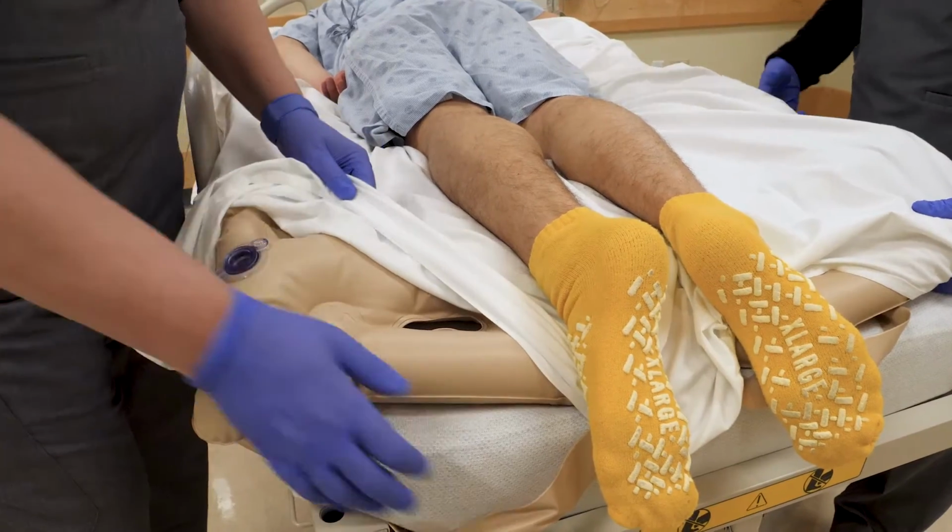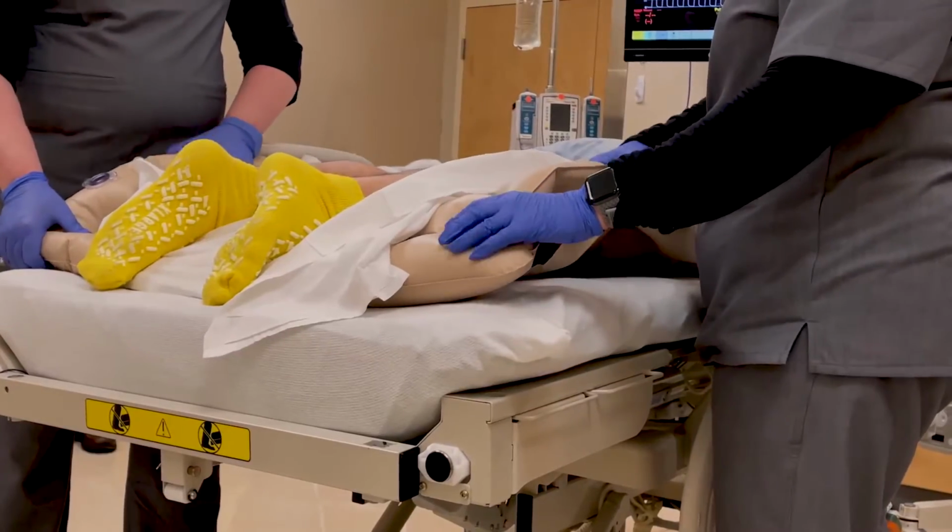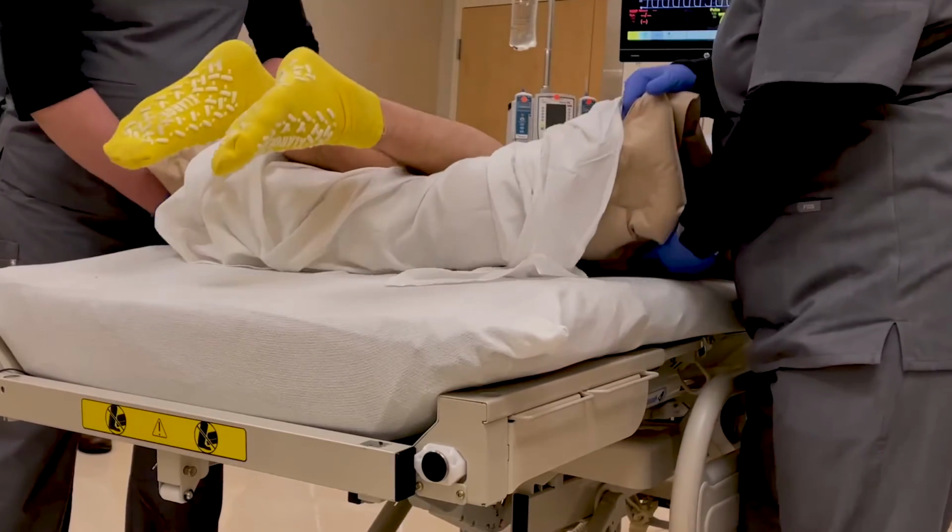Lower the bed rails and remove both Waffle overlay straps at the foot of the bed. Each caregiver grasps the bottom corners of the overlay and gently folds it underneath to offload the patient's toes.